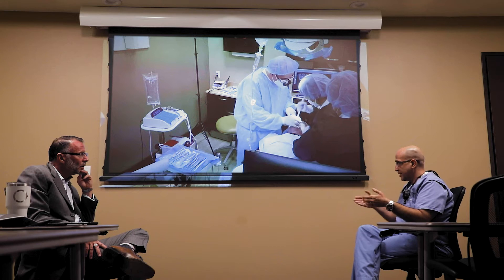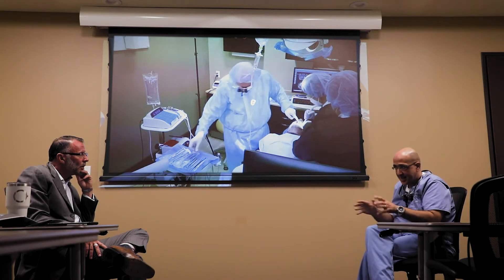This is one type of the all-on-four, all-on-six, or all-on-eight restoration. Because sometimes we don't do reduction at all — sometimes we just pull the teeth only, because there are a lot of issues with the teeth and you just don't need to reduce bone. We just go with the implant inside the sockets and do a full arch bridge on implants without having to do reduction. It's not cookie cutter — it's a case-by-case thing.